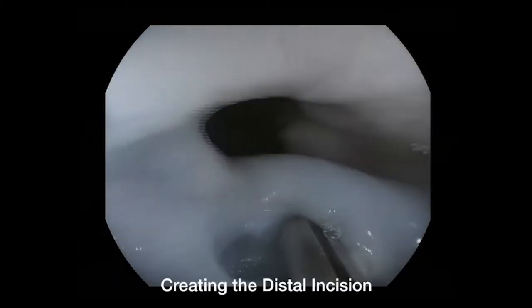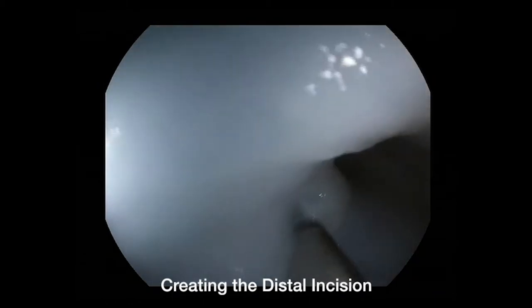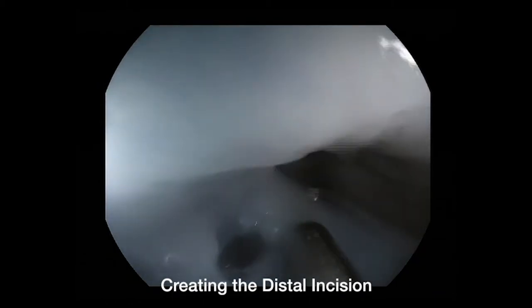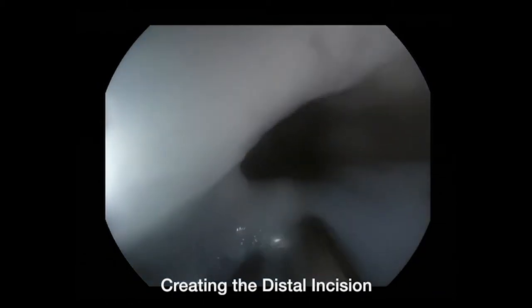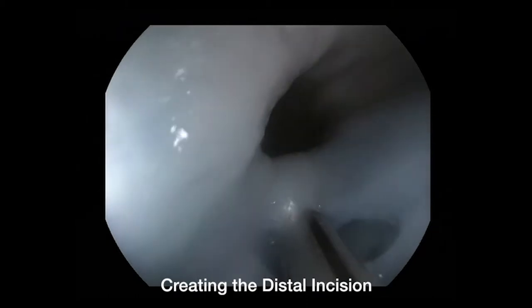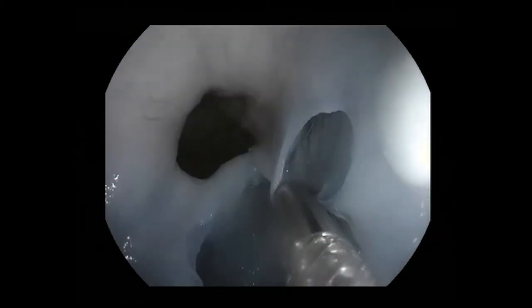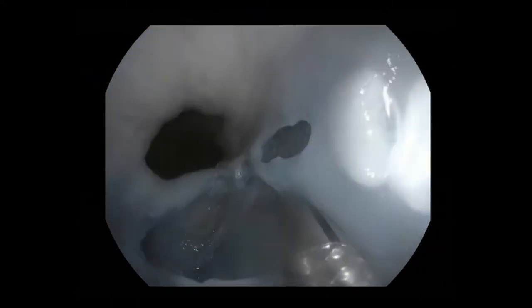After the overlying mucosal area has been lifted for endoscopic submucosal dissection, the distal end and the two lateral edges are incised using suction and mechanical cutting until finally the resection specimen is released. The specimen is then withdrawn en bloc using forceps.